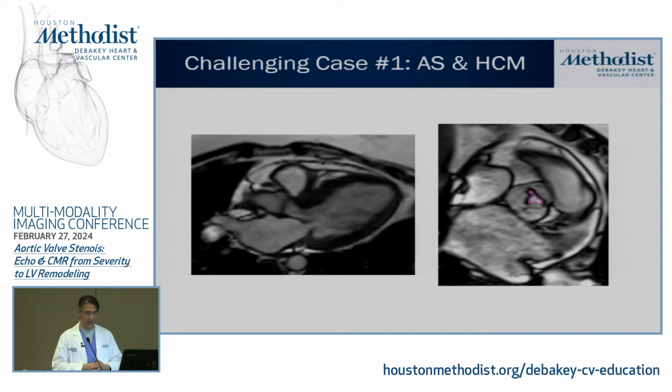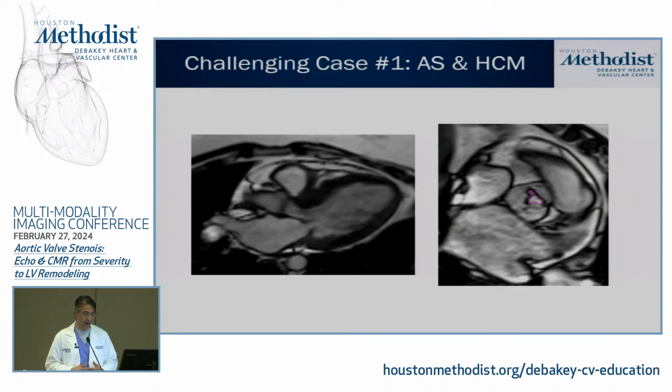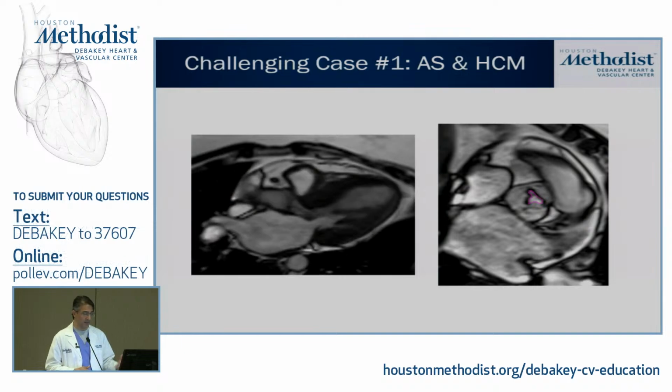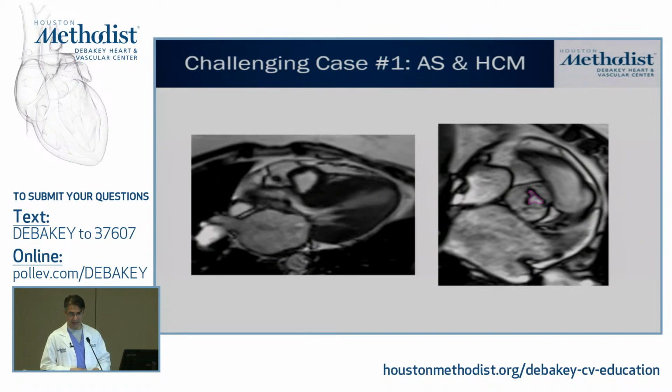How can planimetry help us? So I think a very challenging case was also mentioned by Dr. Shrublu, those cases that have obstructive hypertrophic cardiomyopathy, and maybe you see a lot of calcification of the aortic valve and have some accompanying flow acceleration across the valve. So in this study, I hope you can appreciate that you have not only some systolic anterior motion of the mitral valve, you've got some flow acceleration in the LVOT, and then you have flow acceleration at the level of the aortic valve as well.